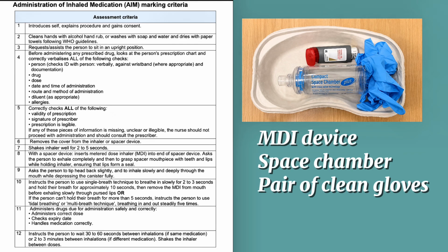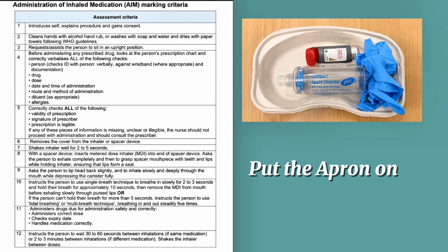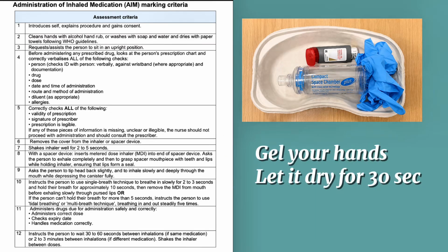Next one is a compact space chamber. Miss Examiner, is this compact chamber less than a year old? So it's clean and intact. And a pair of gloves. So I'm going to apply now the apron. Gel my hands. Let it dry for 30 seconds. You can verbalize, which is let it dry for 30 seconds.